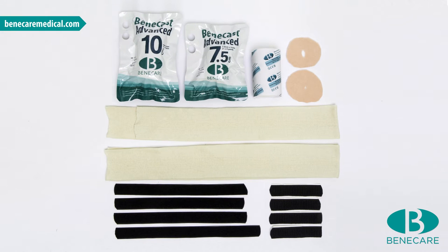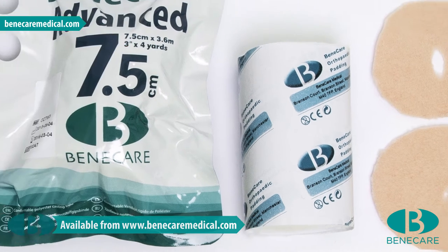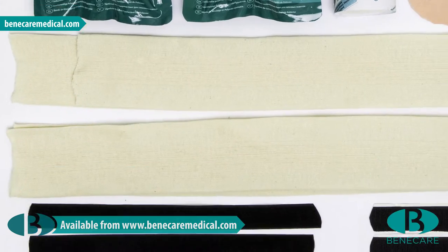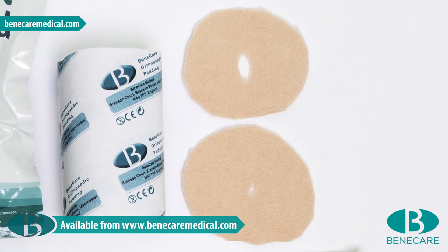The products required for this application are Benecast stockinette, two pieces of 7.5cm. Benecast synthetic undercast padding, one roll of 10cm. Benecast Advanced, one 10cm roll and one 7.5cm roll. Benecast adhesive hoop and non-adhesive loop. Adhesive fleecy web or felt for additional protection of bony prominences and also to edge the cast.